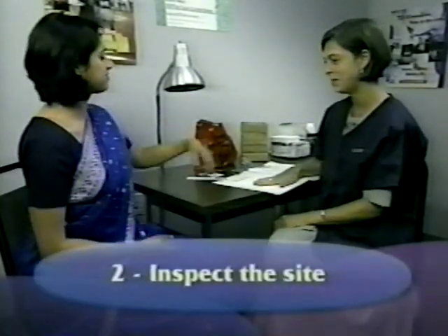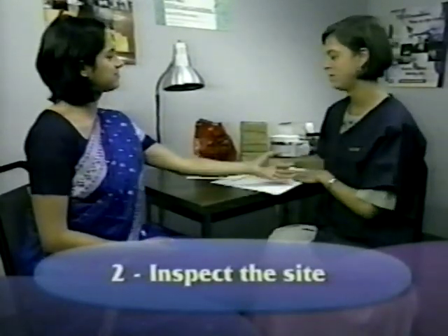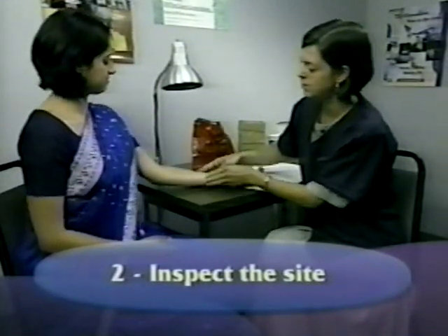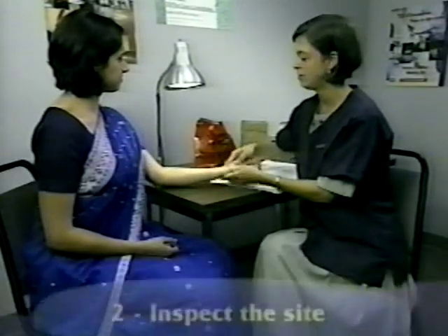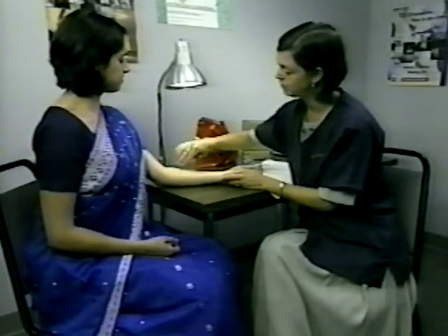To locate the skin test site, inspect the arm in good light and on a firm surface. When the site is on the forearm, turn the arm palm up, support it, and slightly flex it at the elbow.